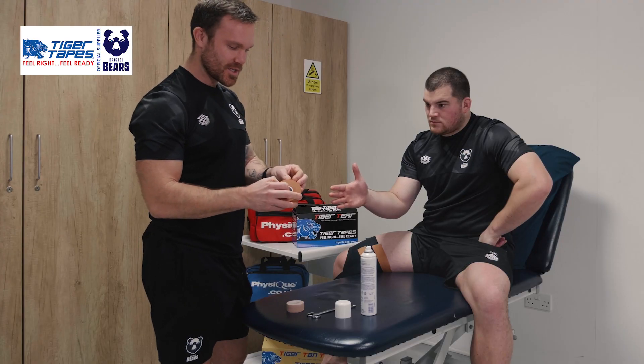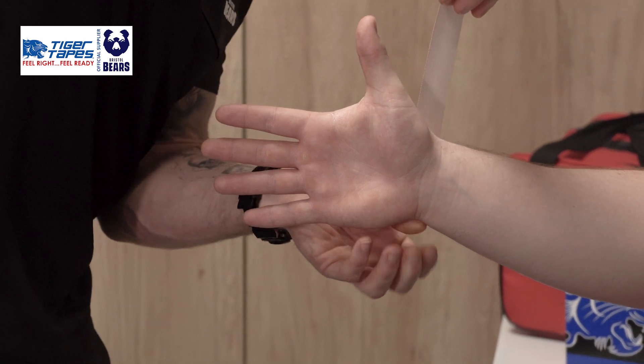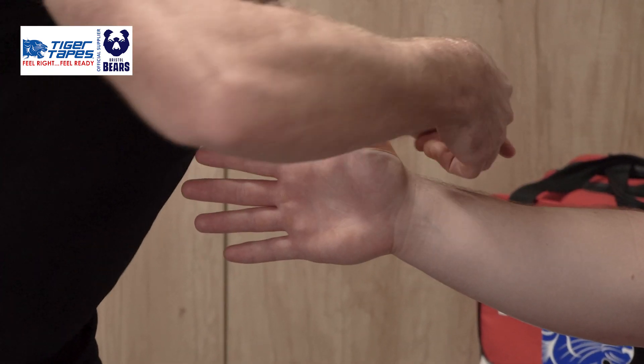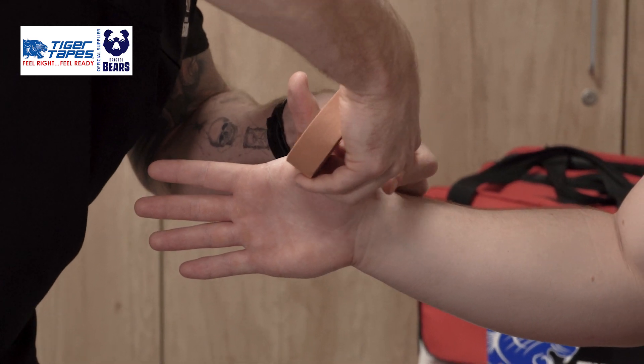Using the 2.5cm Tiger Tan Tape, we'll use this as our base, starting around the wrist at that ulnar styloid, coming around the thumb like so, covering those collateral ligaments and tearing.